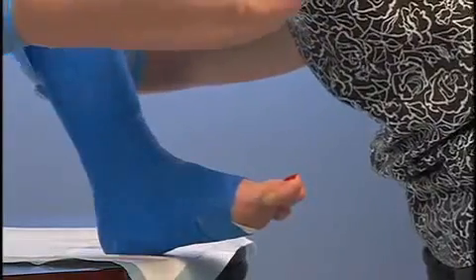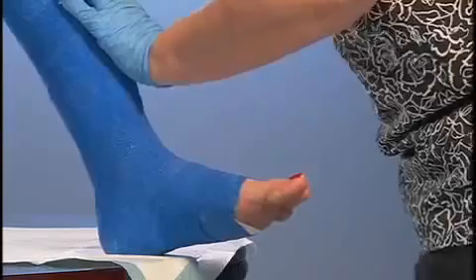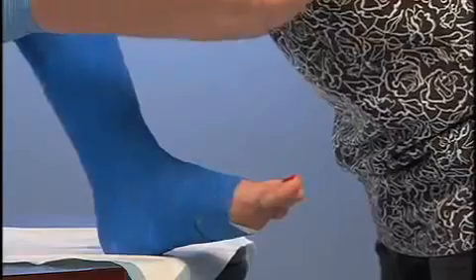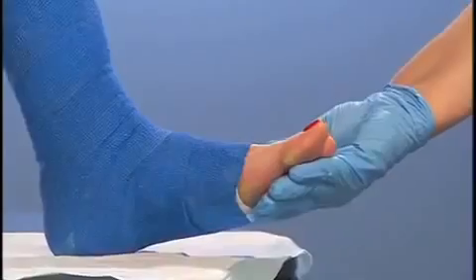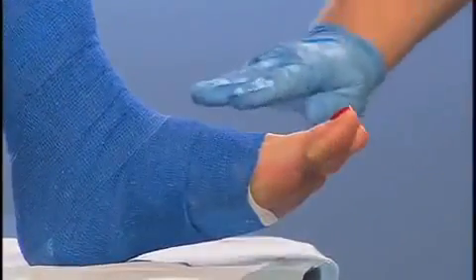Note: an overlay of more or less than 50% will result in inconsistent higher and lower compression pressures. Cut any excess bandage upon reaching the top. Observe the skin distal to the bandage for adequate circulation, such as color, pulse, and warmth.